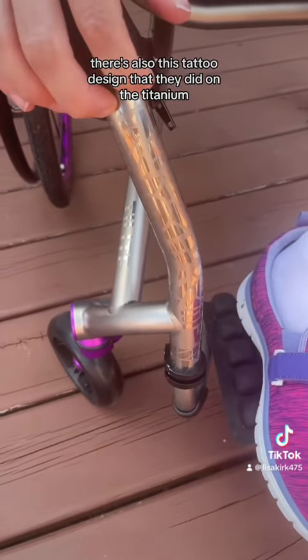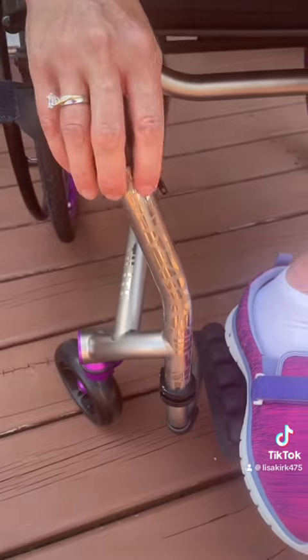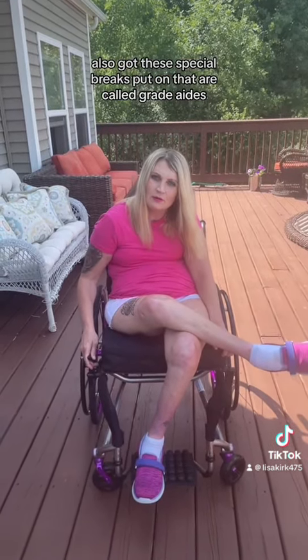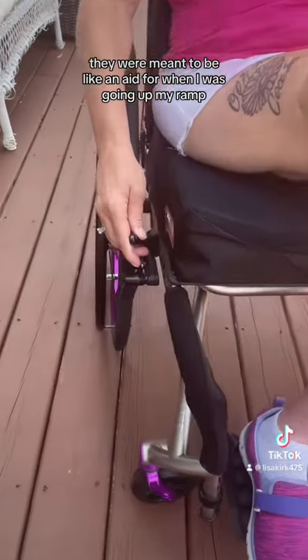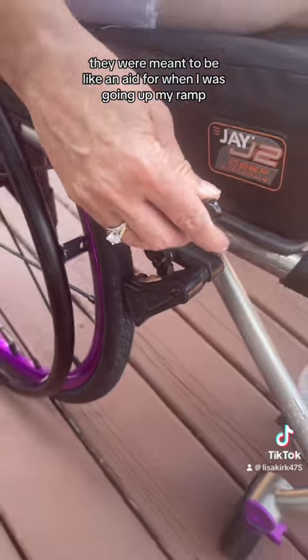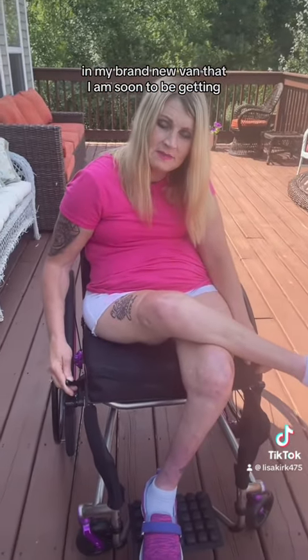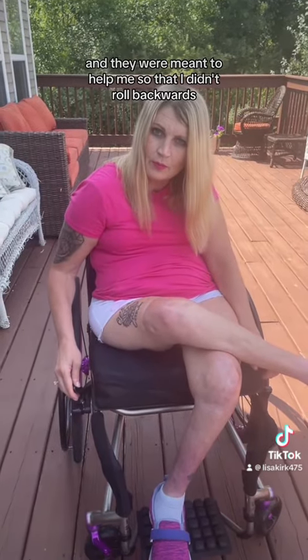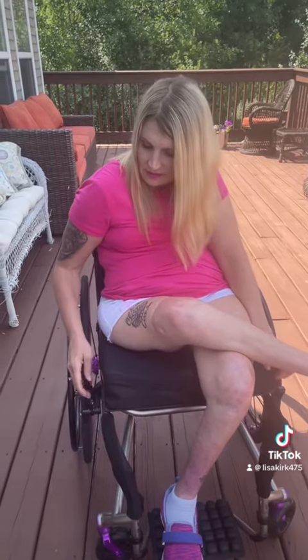There's also this tattoo design that they did on the titanium. I also got these special brakes put on that are called grade aids. They were meant to be an aid for when I was going up my ramp in my brand new van that I'm soon to be getting. They were meant to help me so that I didn't roll backwards.